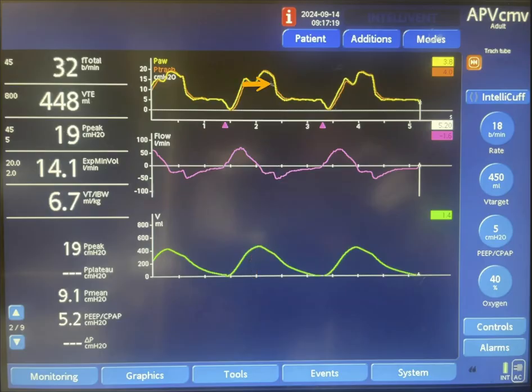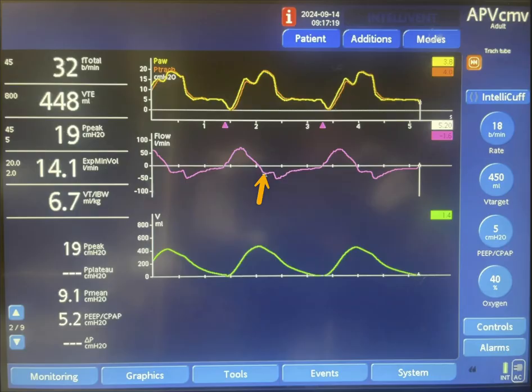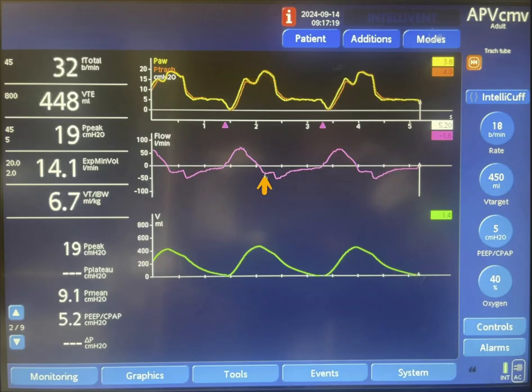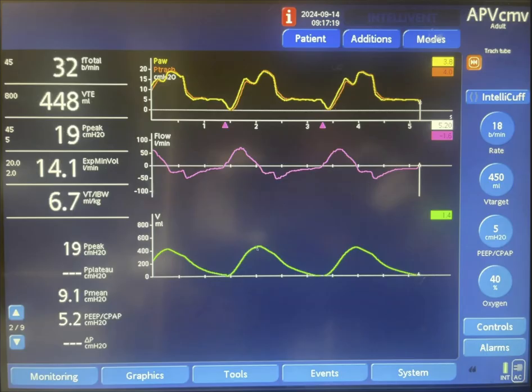Now take a look here — the machine is still in inspiration, but the pressure increased. Let's correlate this with the flow. You will see that we have a negative flow, meaning expiratory flow. Expiration starts here, however the machine is still in inspiration. This expiratory flow resulted in a decrease in volume from 450 ml down to around 380 or 390 ml. This is the amount of air that is exhaled because of the expiratory efforts of the patient during the machine's inspiration.